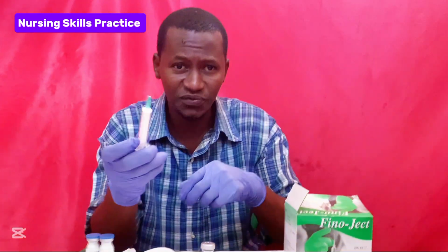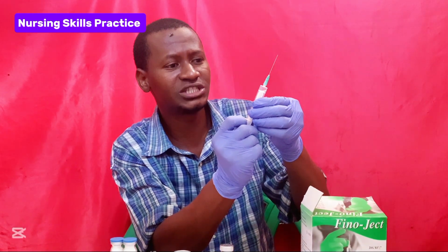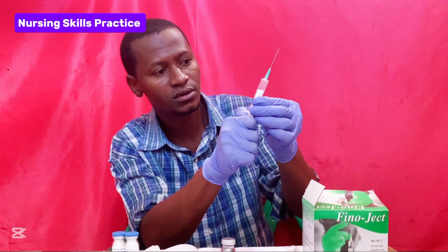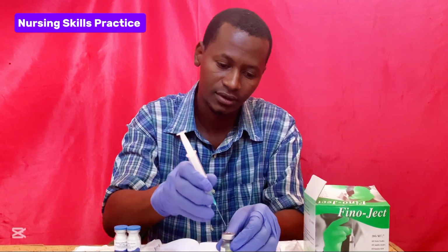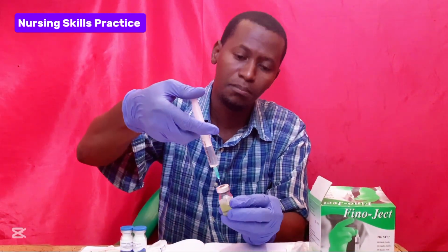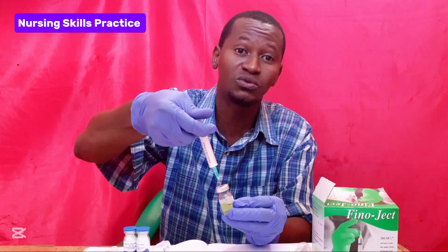Then you have to put first an equal amount of air into the vial. So we have diluted it with 2.4 ml of sterile water for injection. Then you put an equal amount of air into the vial. Make sure you add an equal amount of air into the vial before you start withdrawing the drug from the vial.